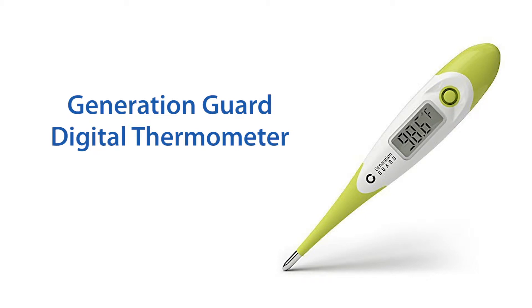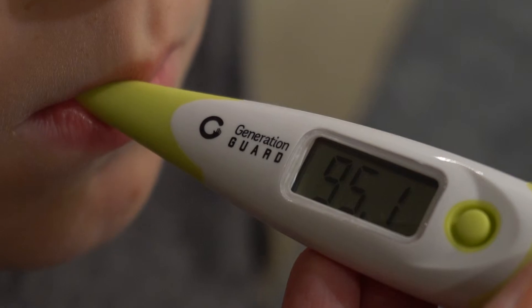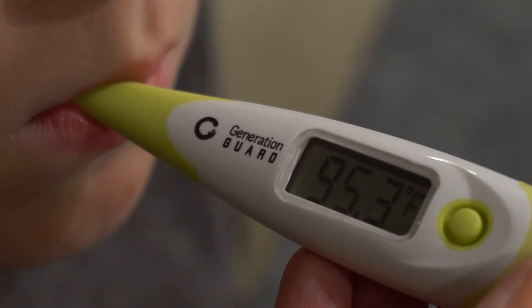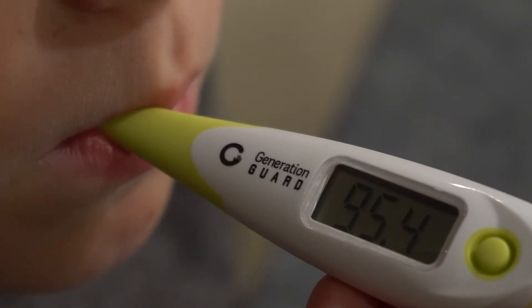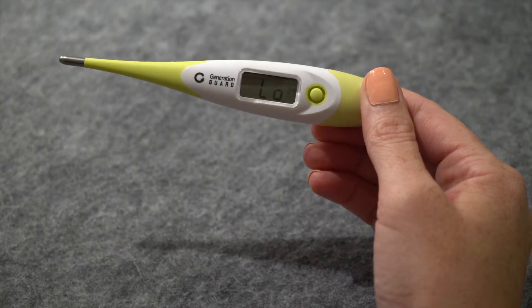This digital thermometer is a maximum type thermometer, so it will take the highest temperature reading and will continue to read temperatures even after the beep until the temperature stabilizes.